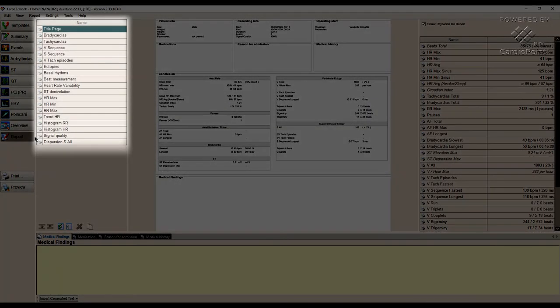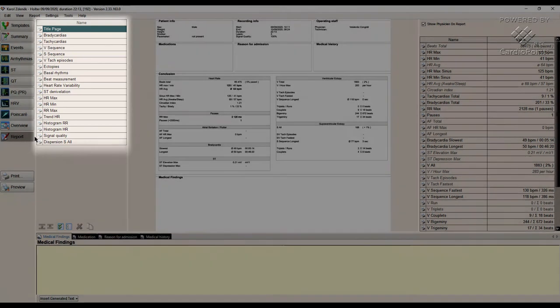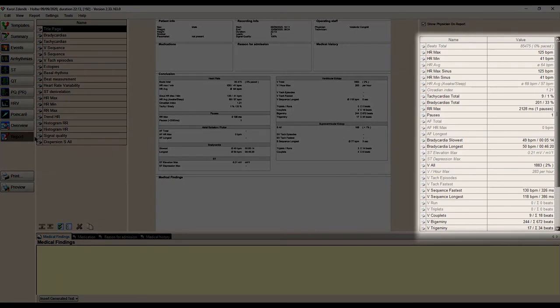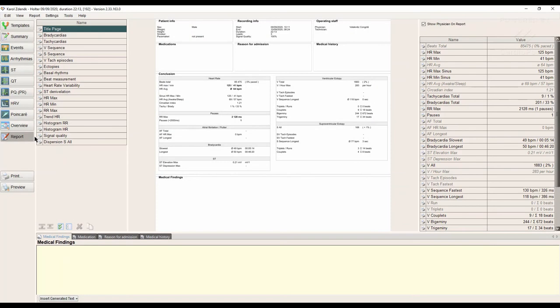In the left window, we can select the pages we want to include in our report. In the right window, we choose the specific parameters that we add on the title page of our report. You can include or exclude any parameter from the report by clicking on the printer icon.